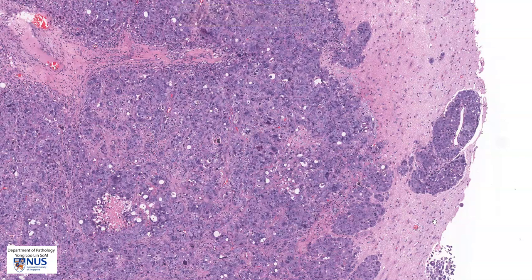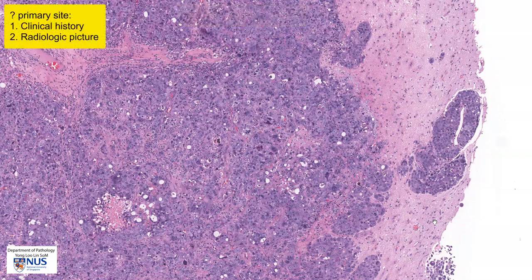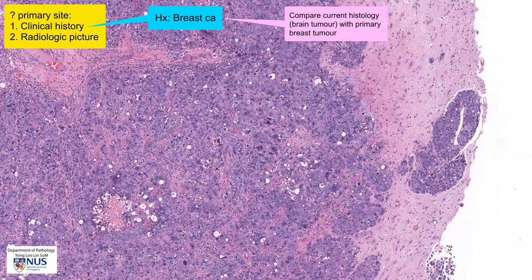In order to ascertain the likely primary site, the clinical history and the radiologic picture are very important. This patient had a history of breast carcinoma. To confirm whether this is indeed metastatic breast carcinoma, we can compare the histologic appearance of this brain tumour with the original histologic appearance of the breast carcinoma to see if they look similar. We can also apply some immunohistochemical markers, as there are markers that are more frequently expressed in breast carcinoma.